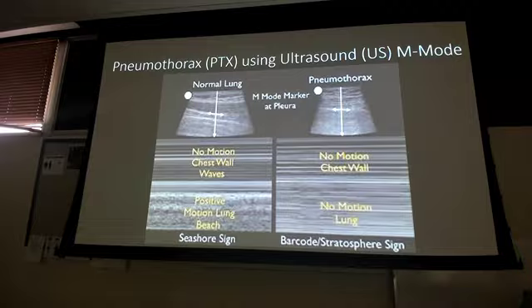Sir, is it reasonable to find out where the hilum is by counting the ribs? Not necessarily. No, you can get a generalized area, but there's no specific rule like the hilum is always in between posterior ribs 5 and 6 or 6 and 7. That is not a thing. So you can have an idea of where the hilum is supposed to be, but it's not like if it's not in between these ribs that it's abnormal. So, no.